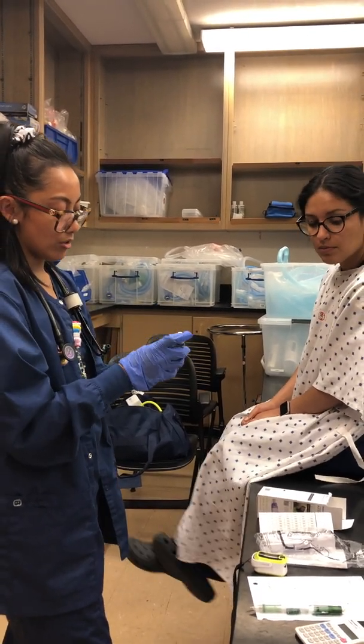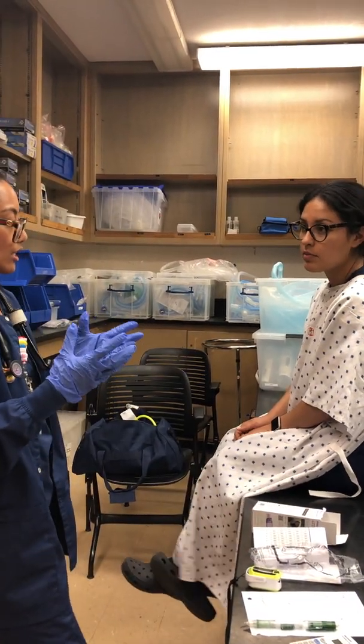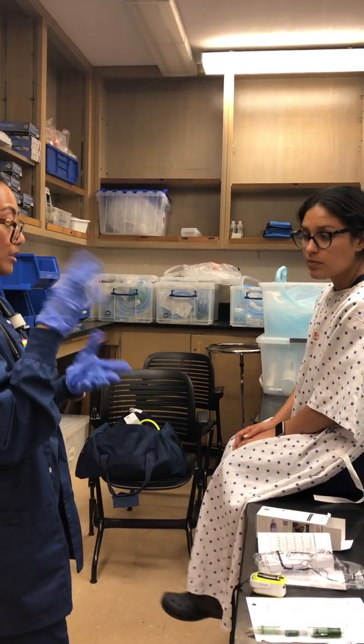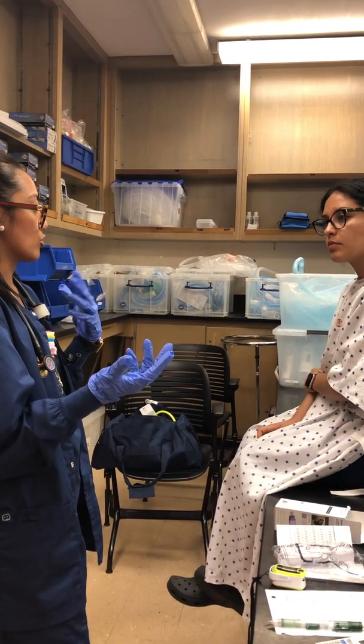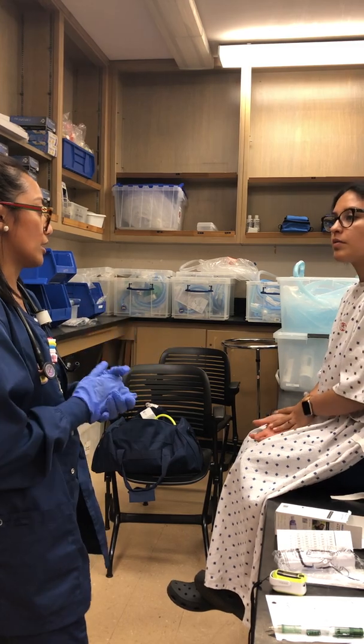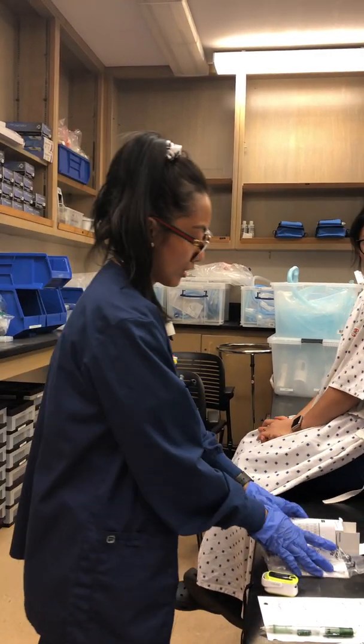So air dry, no wiping, because if you wipe on the inside of the chamber, it will create static, and the medication, instead of being suspended in the air, it will cling to the sides and it won't be beneficial for you to be sucking it in. You'll just be sucking in air. Okay. So, any questions by any chance? No, I think I got it.